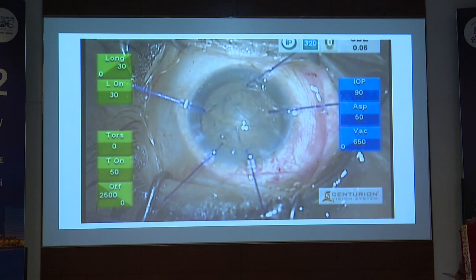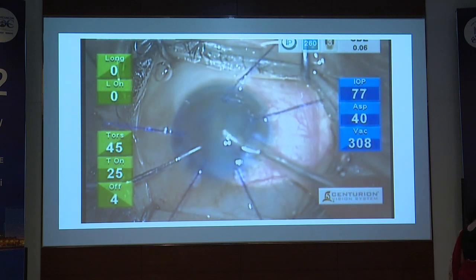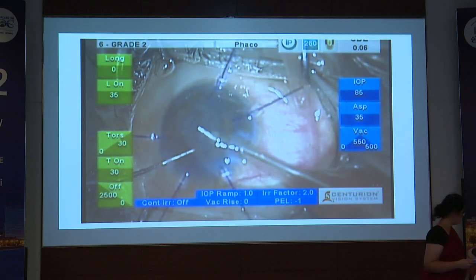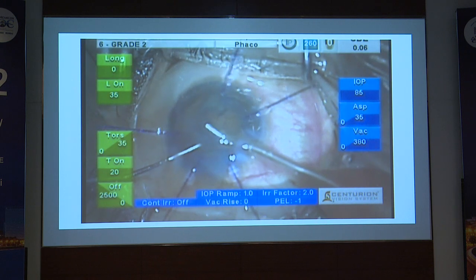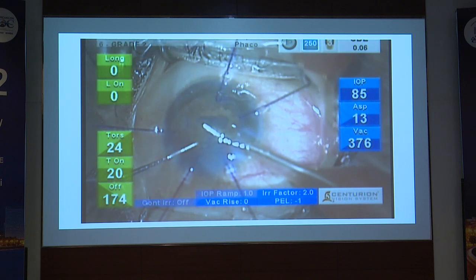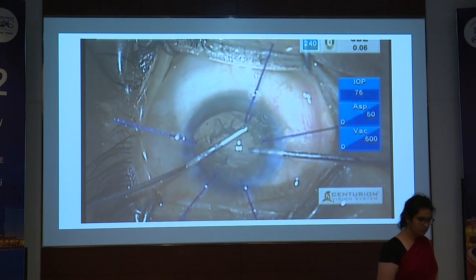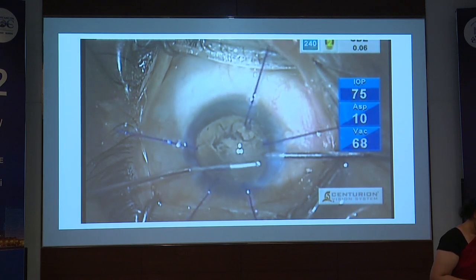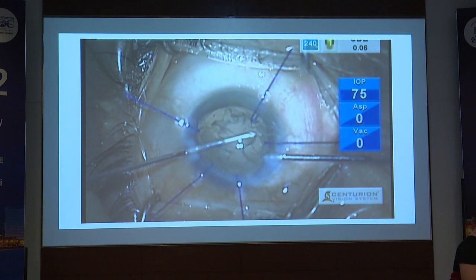Once the bag is well stabilized, you can just use phaco and remove the pieces. You can see that because of the 5 hooks that we have put and not 4, there is more equitable distribution of force, and because of that, the bag doesn't move at all. The bag is absolutely stable. Do a slow and stable IA, and pull the cortex off from the fornix.